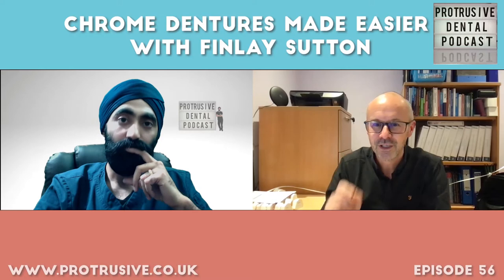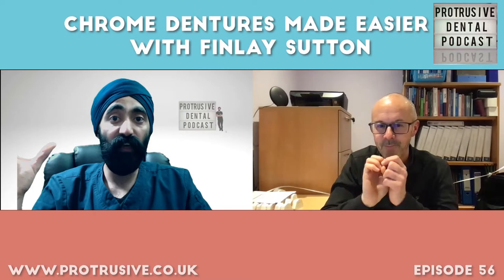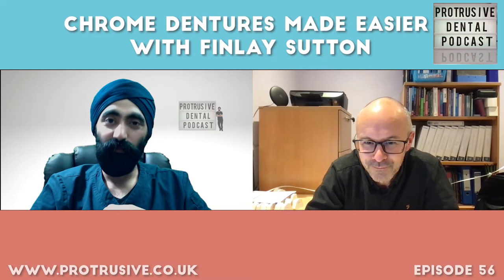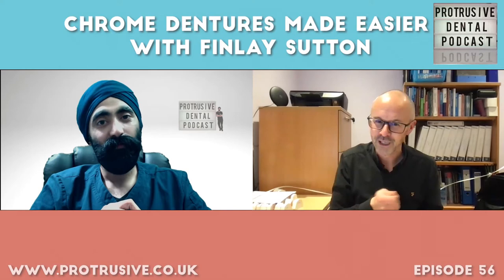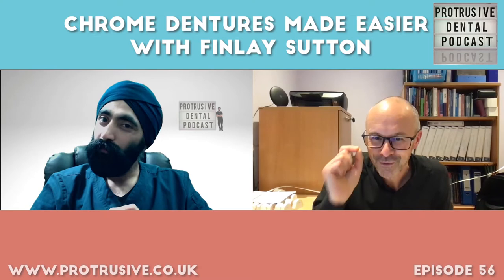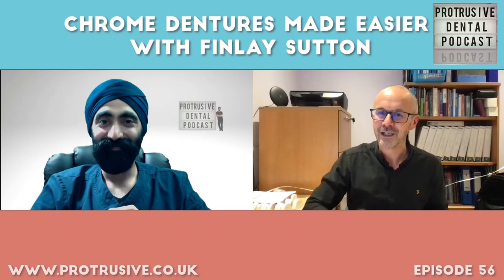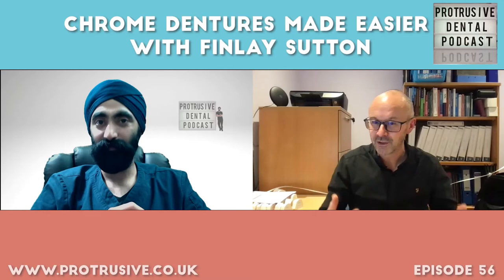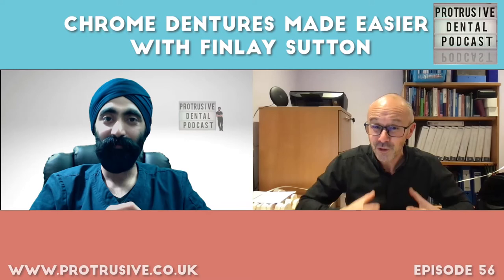Just to clarify: the Occlude spray goes on the denture fitting surfaces — spray onto the surfaces where the denture will fit against the teeth — and the denture picks up the powder. Wherever it touches the tooth, the powder rubs off, revealing the problem areas as pink or silver showing through. Then you gently grind those areas away. For chrome, use a chamfer crown prep coarse diamond bur in a speed-increasing handpiece and just shave that area off — but avoid the top of the clasp.